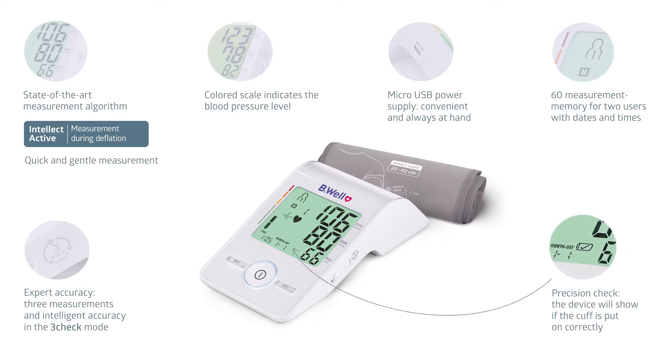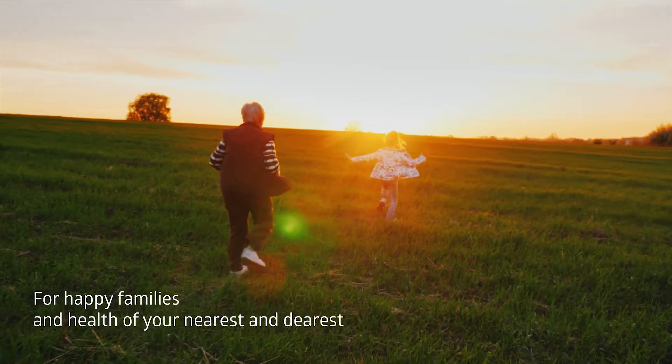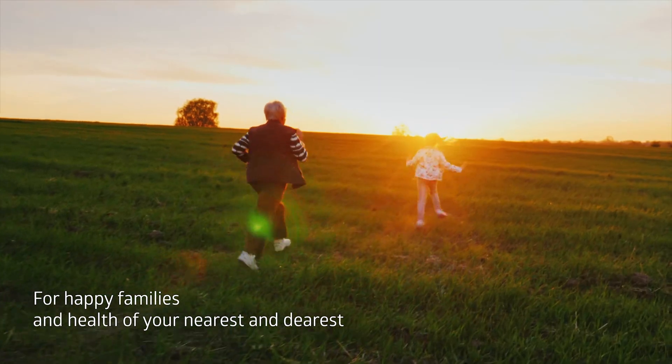To avoid measurement errors, the device will show if the cuff is correctly fixed. The unique Med55 tonometer enables you to control blood pressure with expert precision. Be Well makes taking care of your loved ones' health convenient and easy.